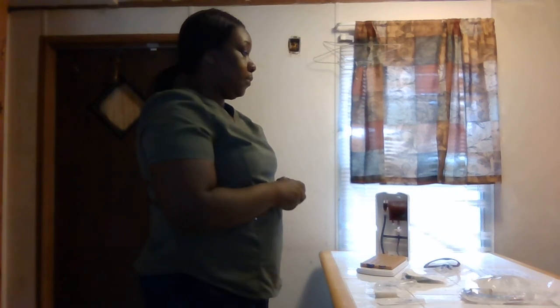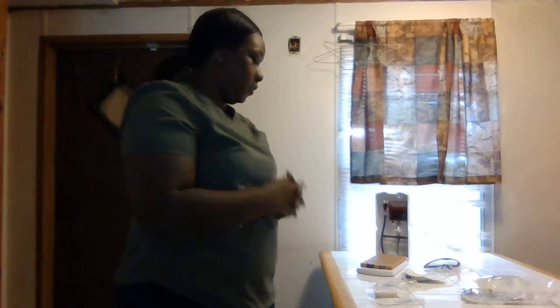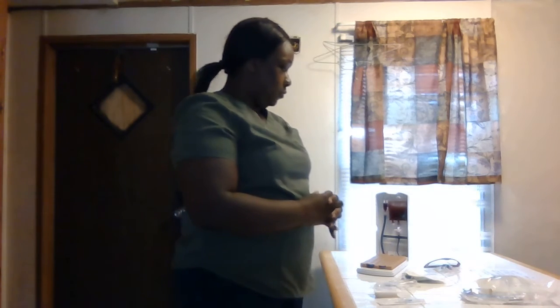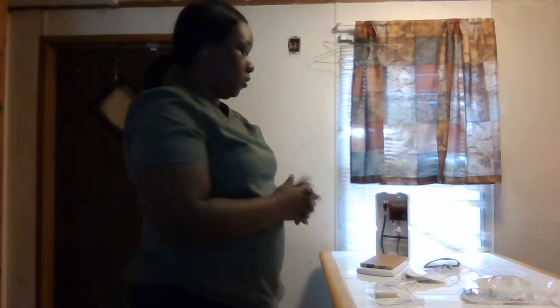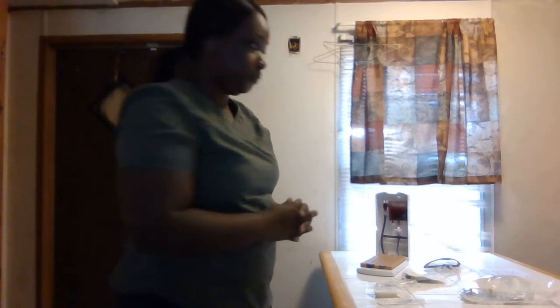Always wash our hands and introduce myself. Hi, my name is Jessica. I'm going to be your nurse today, and I'm going to be doing a venipuncture, giving you antibiotics, giving you a medication, and later on you have to go to x-ray, so I'm going to convert to an INT. Ultimately, at some point, we can discharge you home, and I will discontinue the IV.